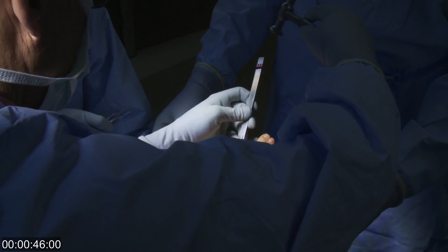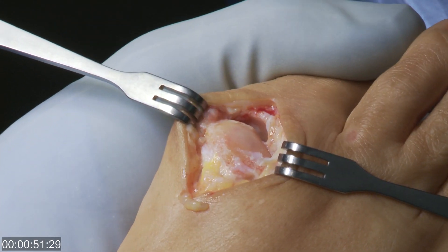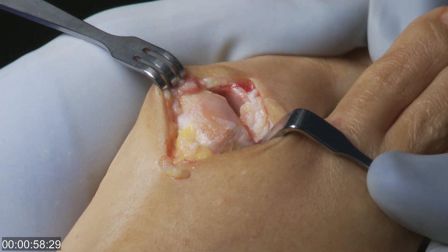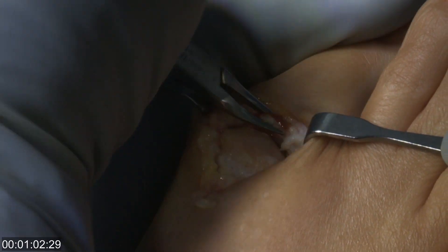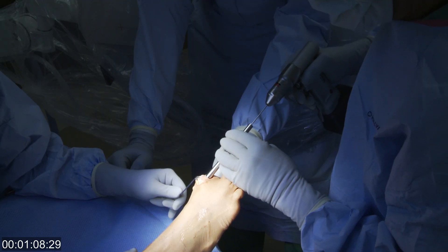The bone spurs are removed with an osteotome and a rongeur so that it shapes the head of the metatarsal back to a relatively normal shape. Once this has been completed and the head is again round, we remove the osteophytes or spurs on the base of the proximal phalanx and get additional motion in the toe.